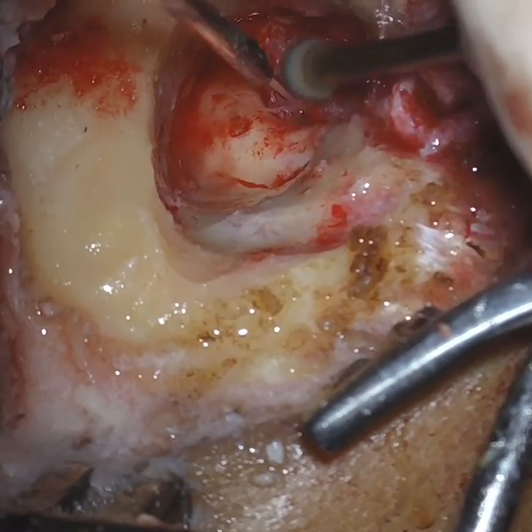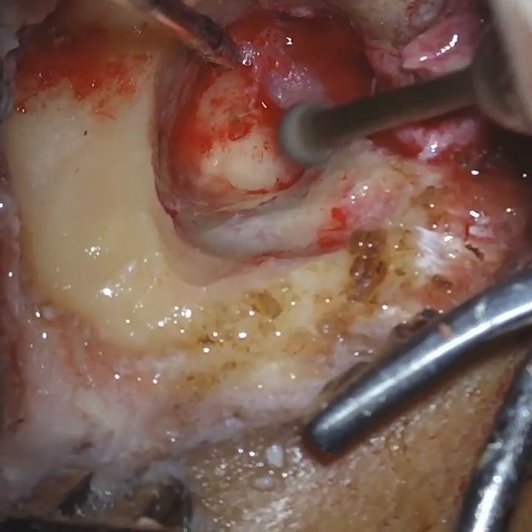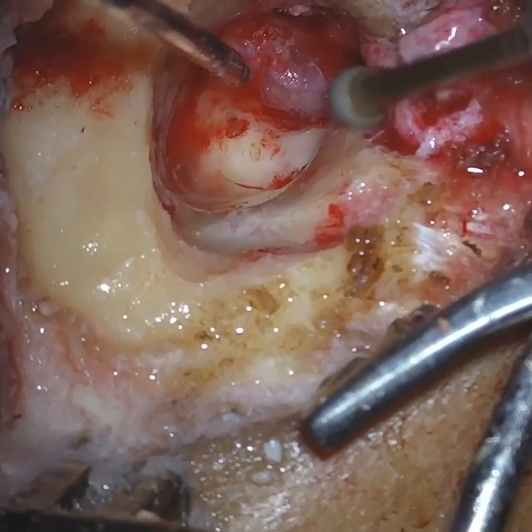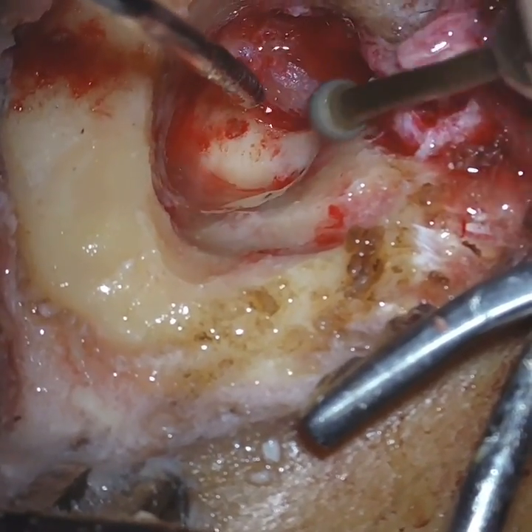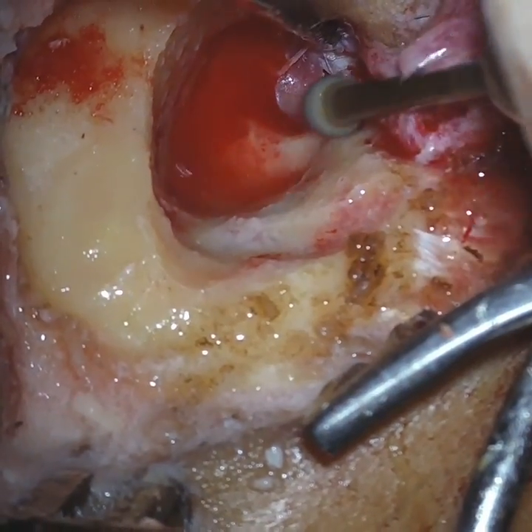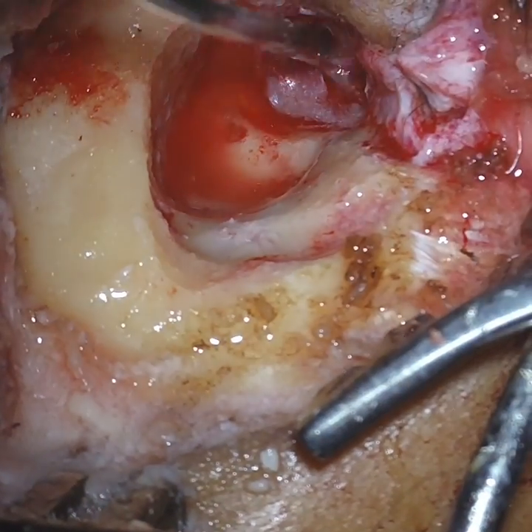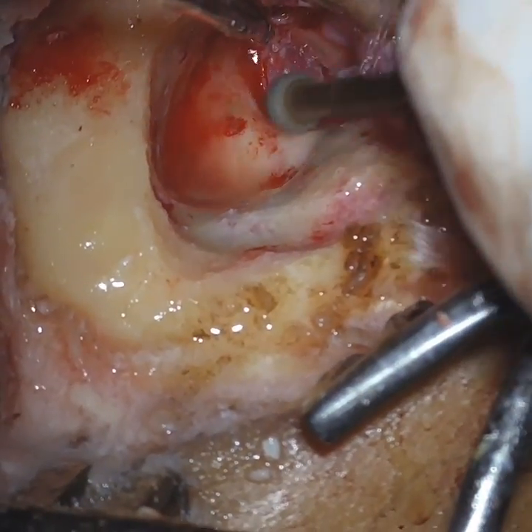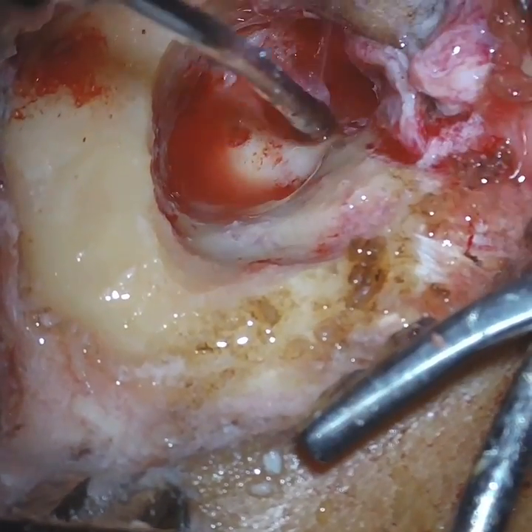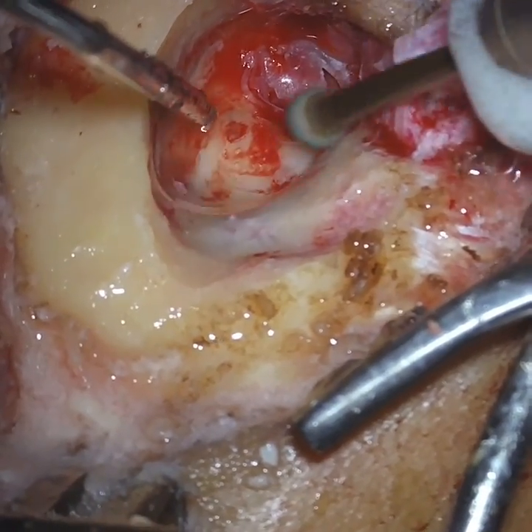So here we are completely lowering the facial ridge, and the best way to lower the ridge for open cavities is once you see where the facial nerve is, just try to expose the facial nerve fully. So you keep on following. The biggest fear of any mastoid surgeon is to injure the facial nerve. But if you have the facial nerve in view and you have identified it and you take the bone around that area, the chances of injury to the facial nerve are hardly anywhere near.